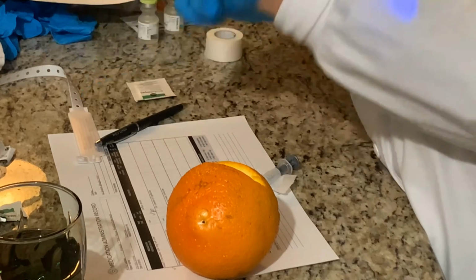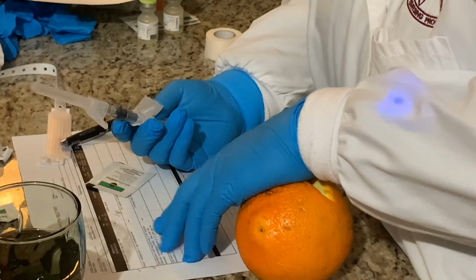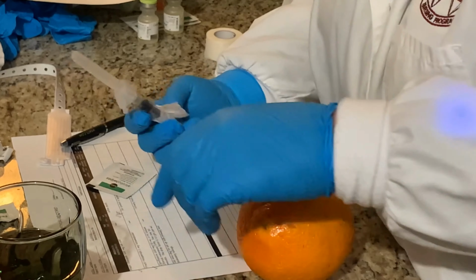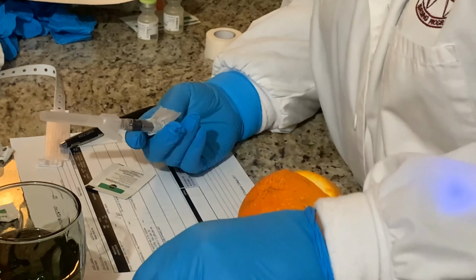Okay, I've got my alcohol swab and I've got my medication. I'm doing my third check now. I'm checking this against the MAR and my label. I have Haldol 2 milligrams. I'm looking at the vial to make sure it says 5 milligrams per ml, so 0.4 is what I'm giving. And I'm giving it to her in her deltoid.